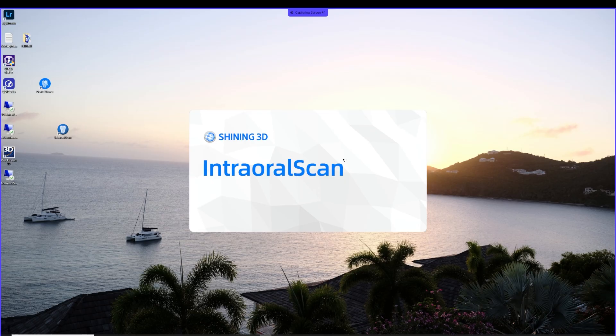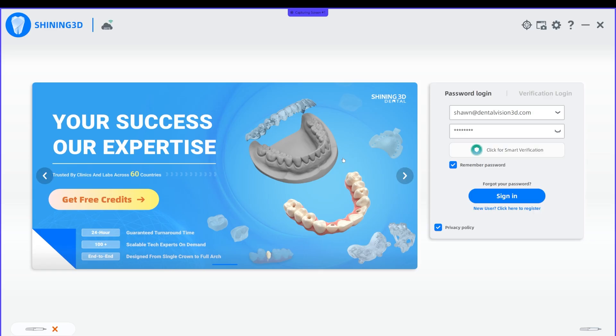We are going to make a model with the new Intraoral Scan Dental Model Maker. I'm going to be using OD01 for this.